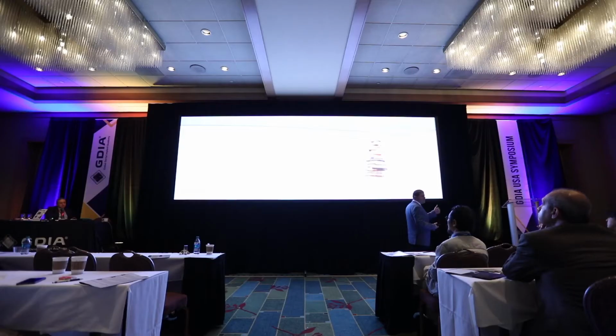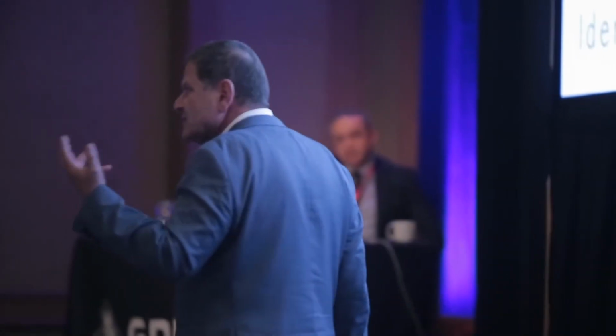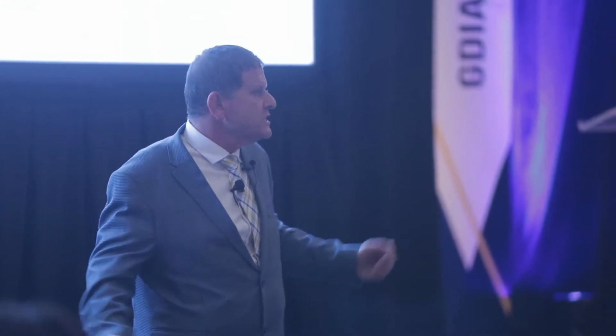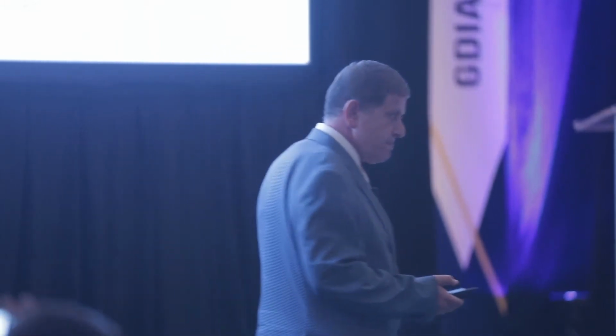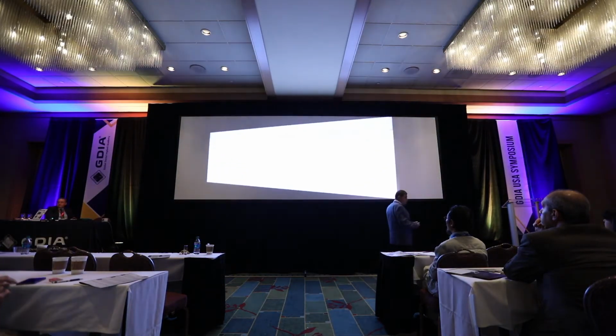Because I saw that it's a self-reinforced, biocompatible, cementable material, totally replaced by the bone, promotes bone formation, an excellent hemostatic material. If there is exposure, almost never will it get contaminated. It has some bacteriostatic nature due to its salt properties. And of course, it's not expensive. So what prevented it from being popular? There were two drawbacks that over those 100 years prevented it from becoming popular.